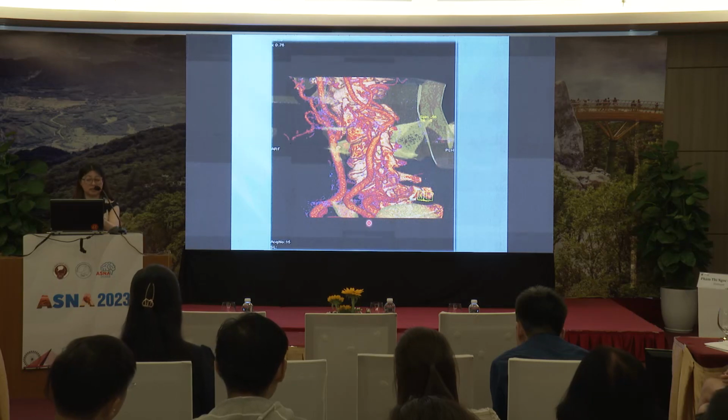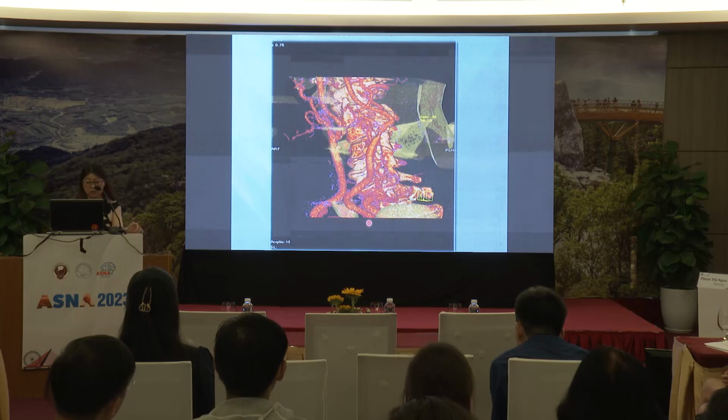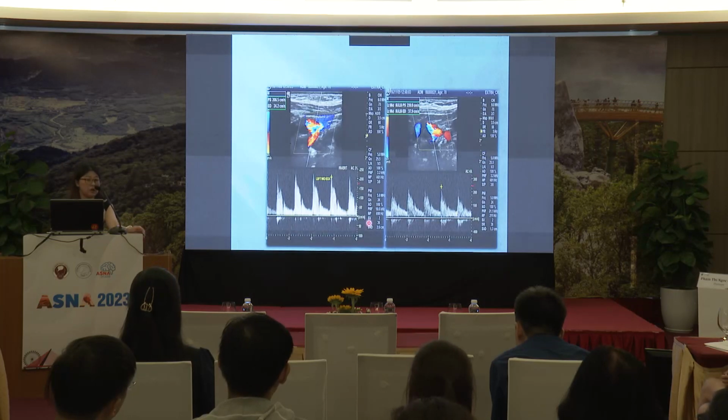And this is the CT angio. So basically, this patient, we did stenting. We did the stenting, and then the patient went well.